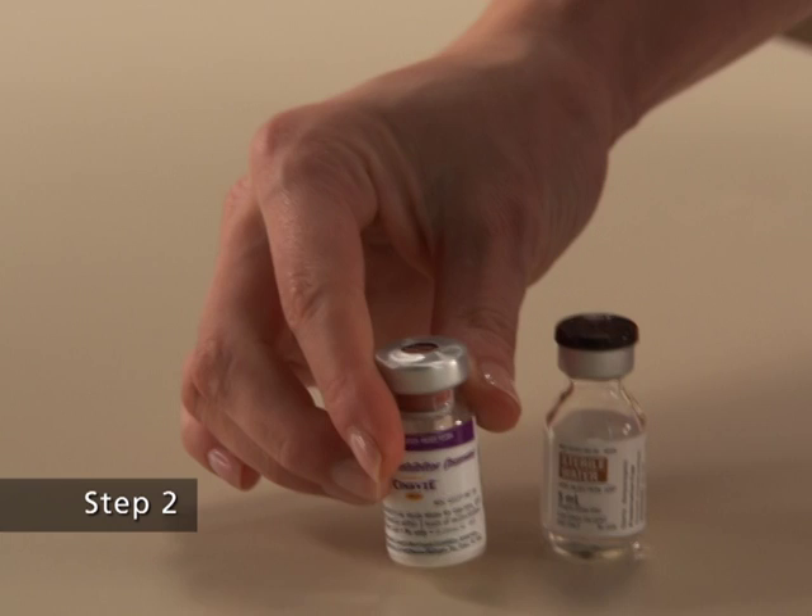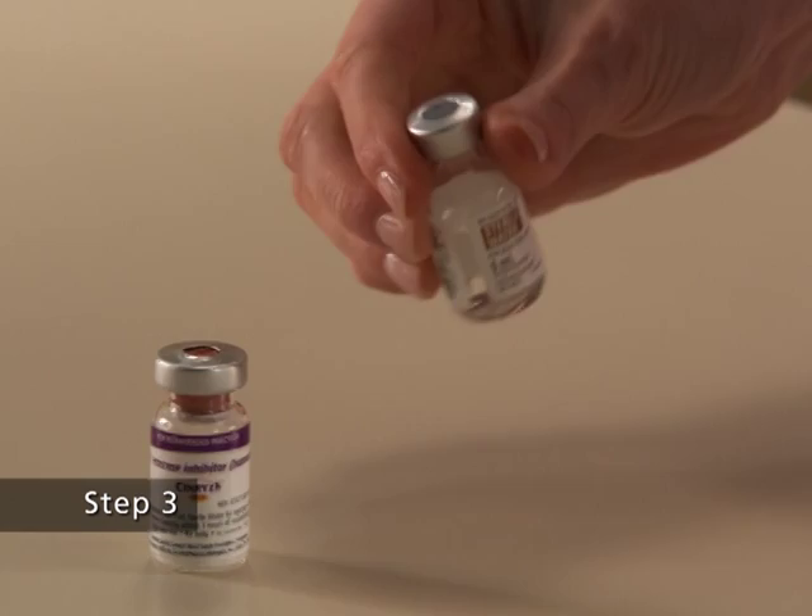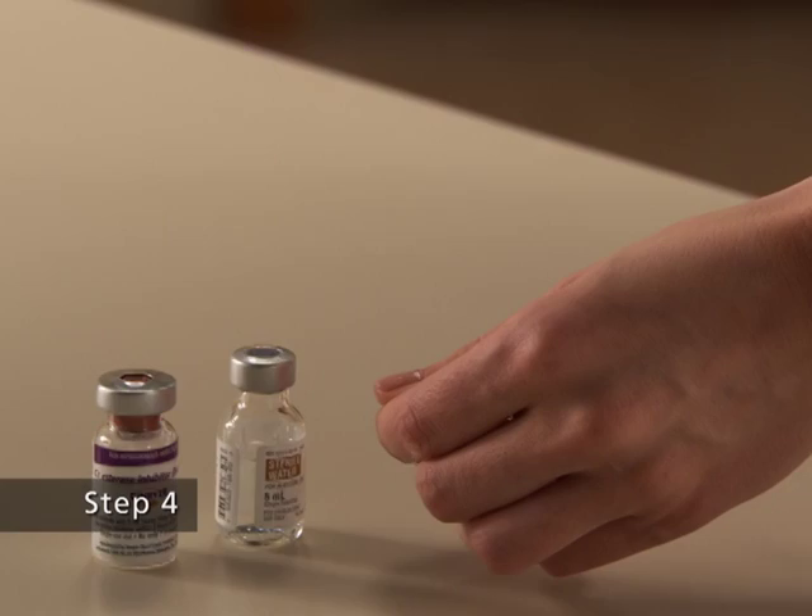Step 2. Remove the cap from the vial of Synrise to show the center part of the rubber stopper. Place the vial of Synrise on a flat surface. Step 3. Remove the cap from the vial of sterile water to show the center part of the rubber stopper. Place the vial of sterile water on a flat surface.